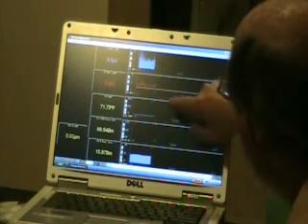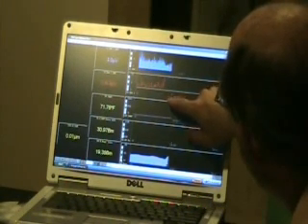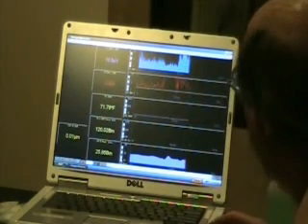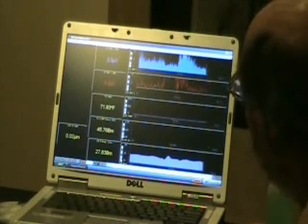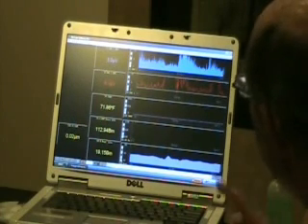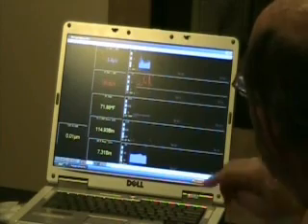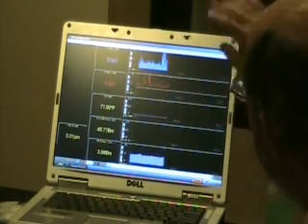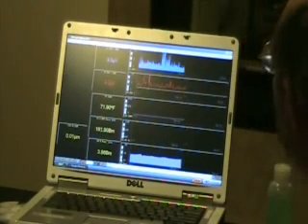So go ahead and shrug your shoulder just up and down. Down, down, down, down. Let it relax. Oh, there it is. Well, let's just see what's happening. I'm going to have you shrug and relax. Okay, so I'm just going to shrug and let go. Okay, we'll do it one more time when I say so. Shrug, let go. Okay, that's normal. It came straight back down immediately. That's fine.